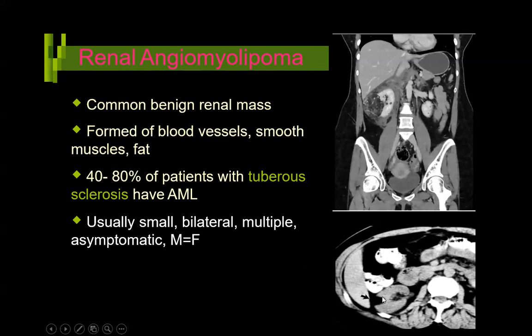Another example of angiomyolipoma, this is a small one. No need to worry about this one, because once they are small, it is very unlikely that they can bleed. They are more common in people with tuberous sclerosis. Okay, the phakomatosis, you can read this, a few conditions where they are seen bilaterally in the kidneys.